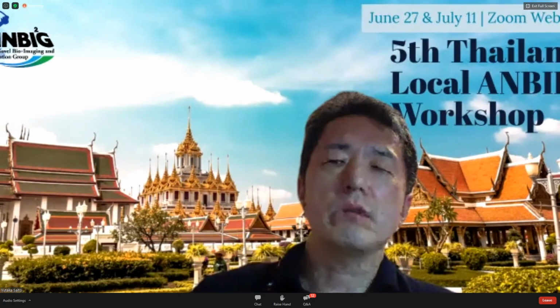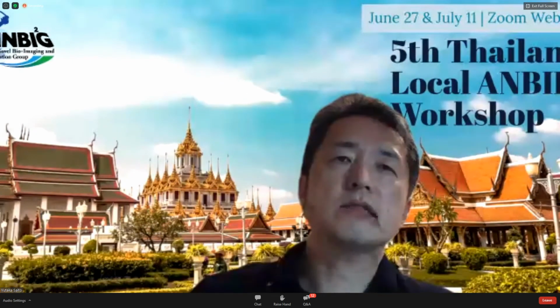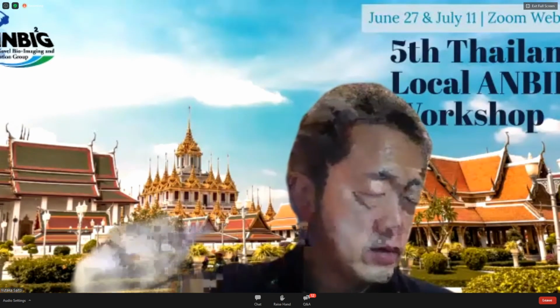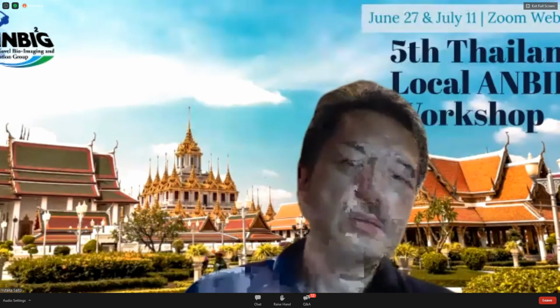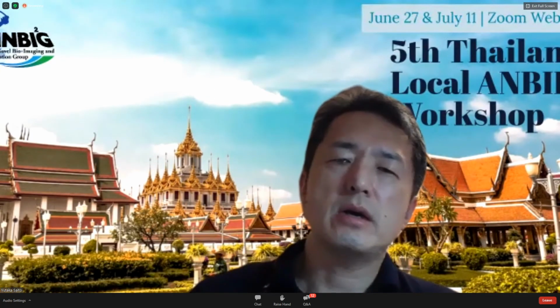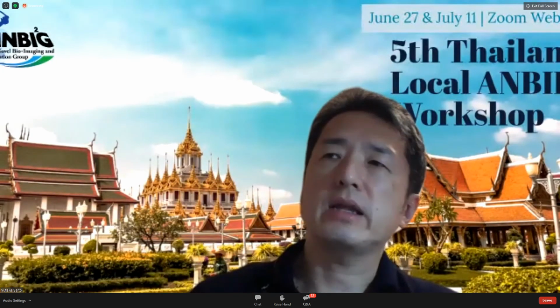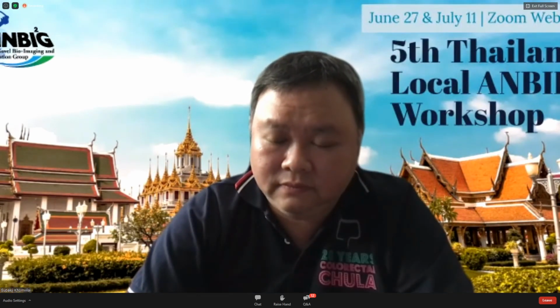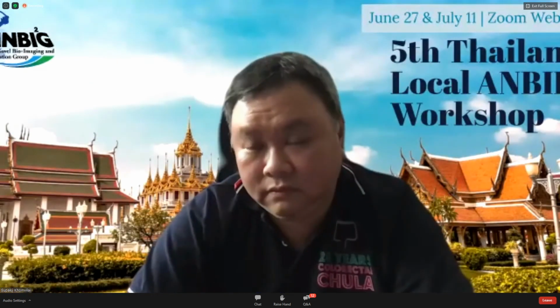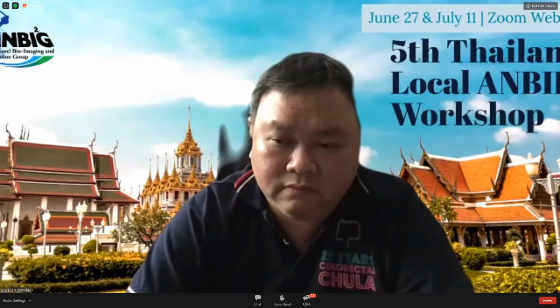Yeah, so patient position is really important in colorectal ESD. It's different from gastric or esophageal ESD. In gastric or esophageal ESD, we usually use deep sedation, so patient position changing is usually not performed. Not only when the region in the stomach is located in the fornix, sometimes the right side down position could be really nice. But in colorectal ESD, routine patient position changing is very effective.